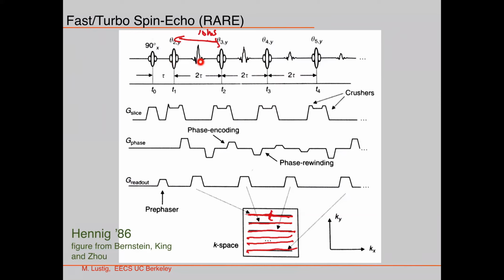And of course, you can imagine how hot that sequence is. Like you can lie in the scanner, and when you do that, you feel the warmth in your tummy sometimes. I don't know if you ever did this. Not the pre-scan, the calibration, but the localizers are often this type of scan, because you want them to be really quick. So you go into the scanner, and then suddenly, it's nice and warm, because of that sequence.